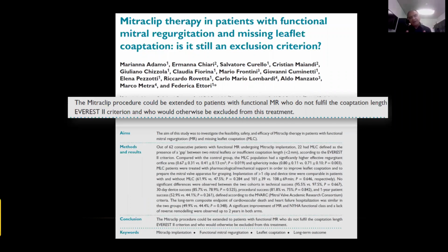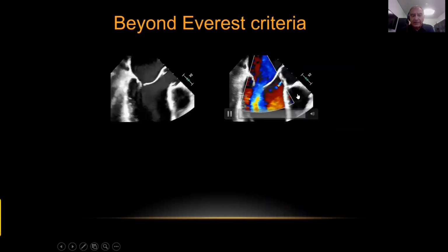Well, if you just reduce this in this preferential way, the left ventricle could not, I would say, contract anymore. It could be some problem, and we do have some of this problem. What do we do? This is an example. We put the device inside. This is one problem.